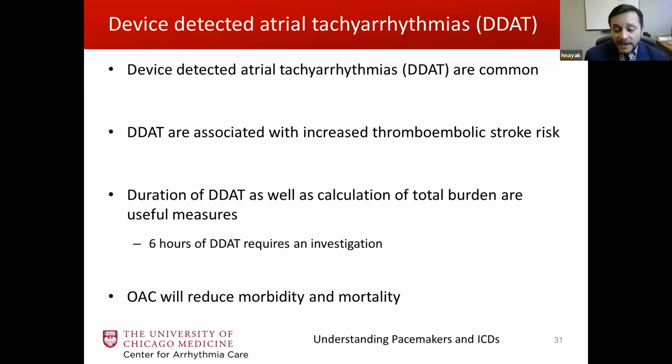Same thing with atrial flutter. Atrial flutter will have a fast atrial rate that will be recorded and sent via alert. How do you tell the difference? You look at the electrogram. The example I showed you showed an atrial tachyarrhythmia. What I didn't show you was that eventually that tachyarrhythmia degenerated into atrial fibrillation. That was clearly seen on the atrial electrogram.